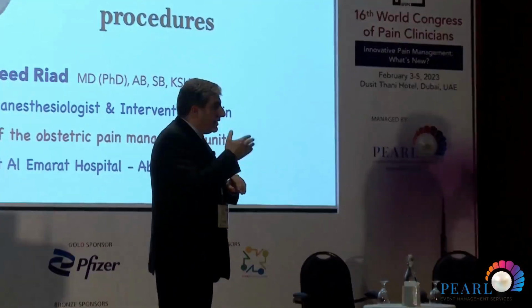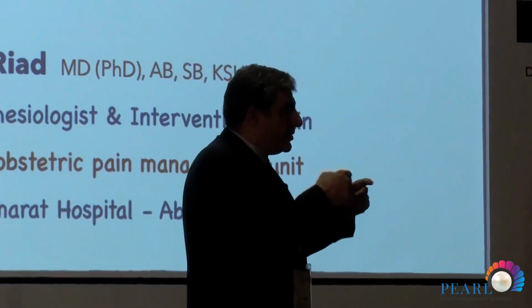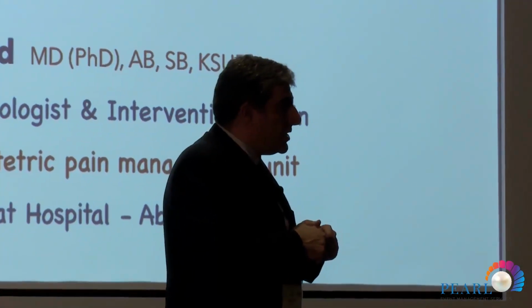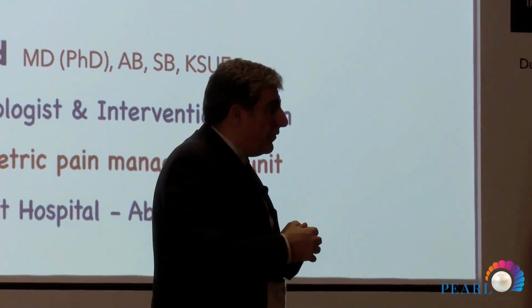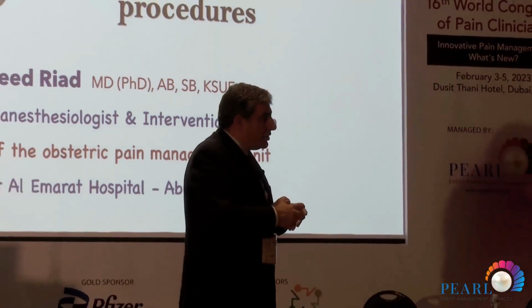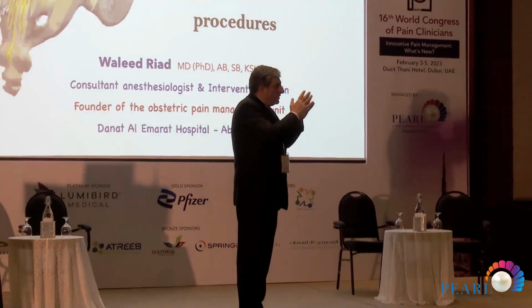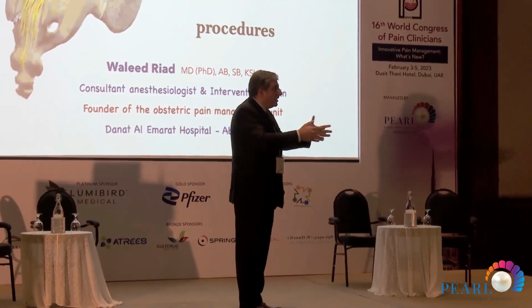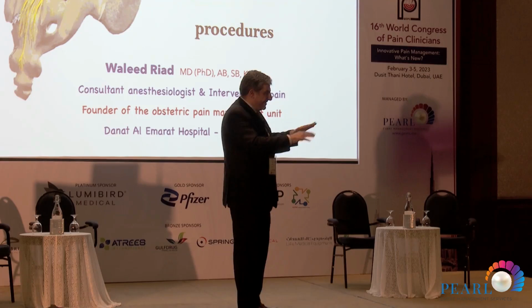No, I've never seen it, but I think I'm very close. Very close to it, because I tried to dissect posterior to the artery and advance a little bit, and I think I need less than a millimeter, because when I checked it over the ultrasound, I was almost there, at the line of the facet joint. So I was almost there. We started with the foraminal steroid injection. Definitely, future plans, we need to expand it to dorsal root ganglion rhizotomy. Definitely this is a must. We need less than a millimeter to be there.